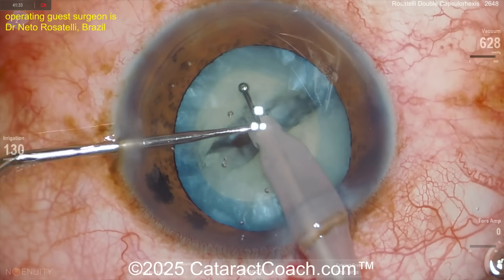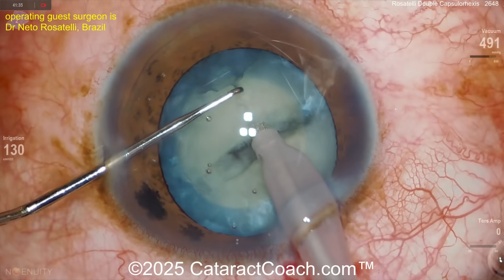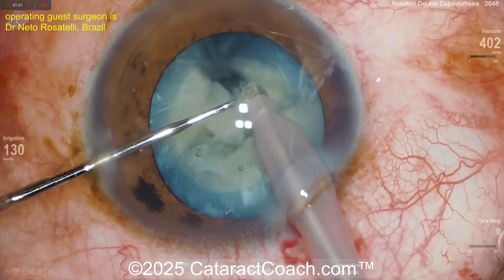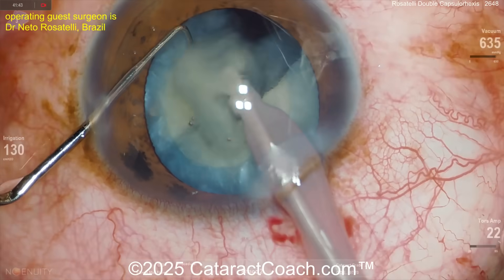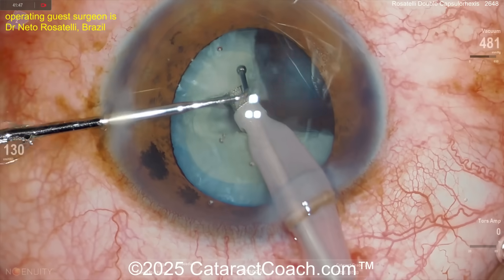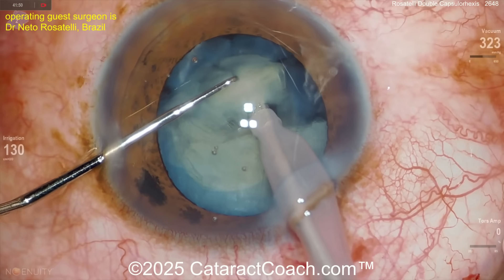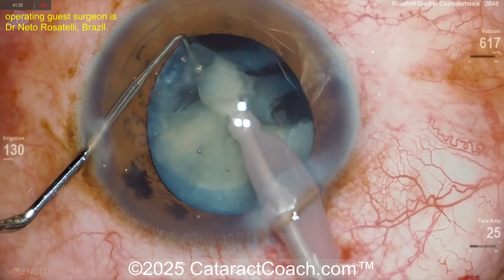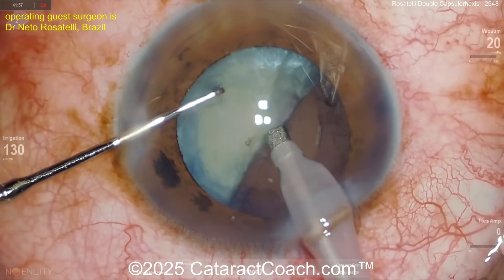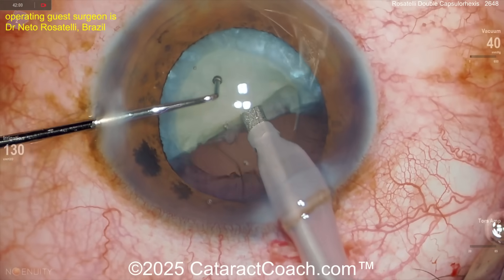There's the stop and chop: two halves. Now going to high vacuum and higher flow. There's the chopper — boom — chop it in half, so now you've got two quarters. A little sub-chop if you need to. A great surgeon can do all the techniques, just like a great basketball player can do a layup, alley-oop, slam dunk, free throw, and three-pointer.